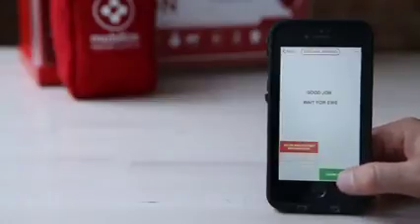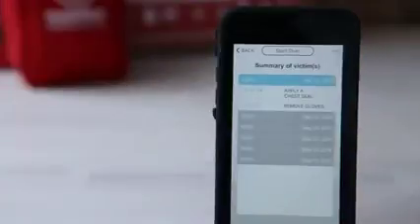And at the very end, there's a treatment summary of everything you've done for this patient. We applied a chest seal and then removed our gloves. Feel free to practice additional scenarios to familiarize yourself with the software. From now on, you have everything you need to save lives.